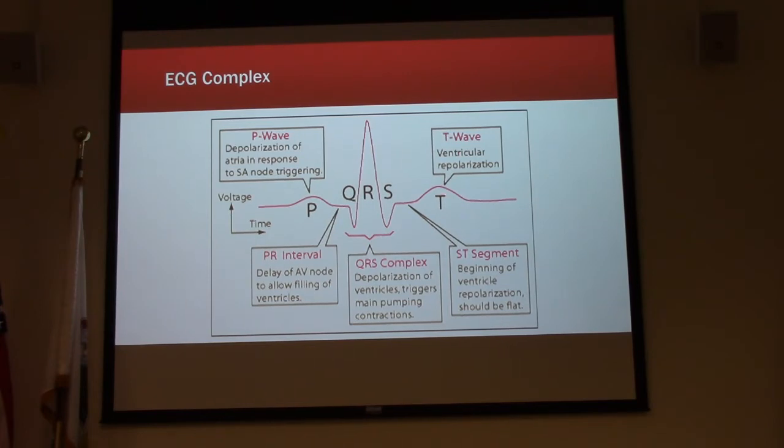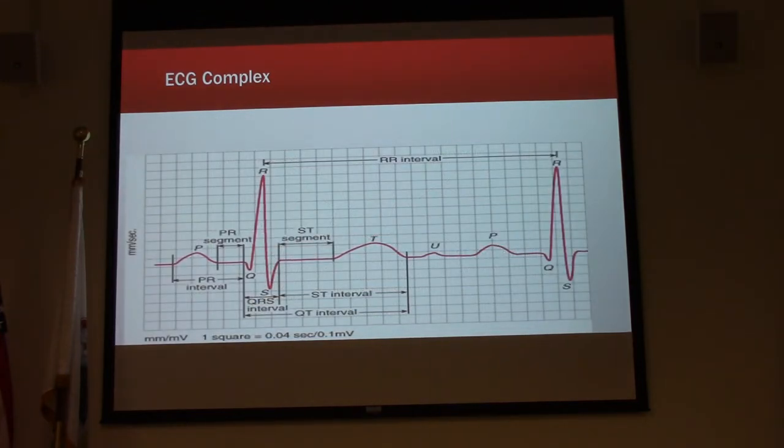If you take a look at the T wave and you break it in half here, you're going to see what we call an absolute refractory period, meaning that in a certain time, that area of the heart or the ventricles cannot be depolarized while they're repolarizing. If you're going to the relative refractory period, then it definitely can be. And we worry about that because if we depolarize the ventricles at the same time they're repolarizing, the heart definitely at that point can end up going into VFib. It can get a little bit confusing.